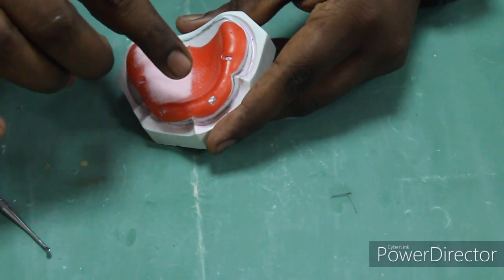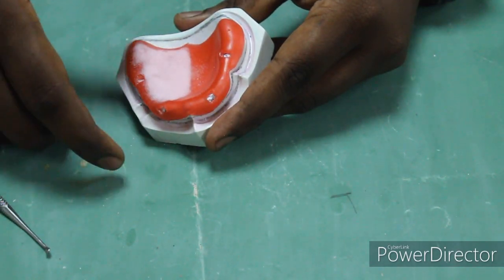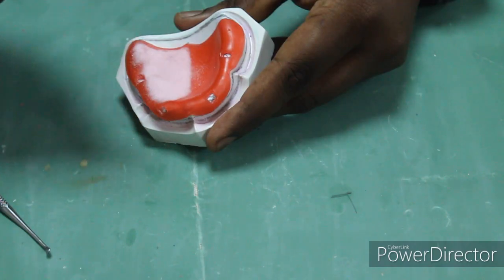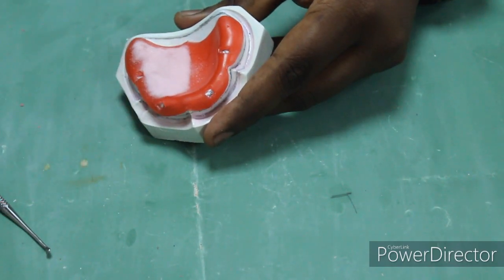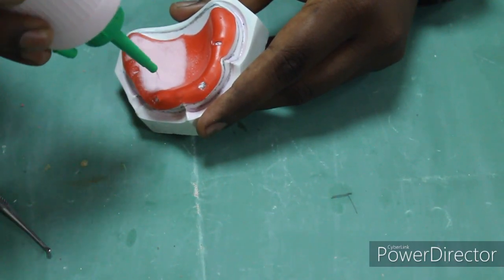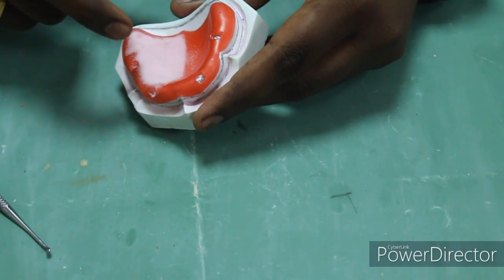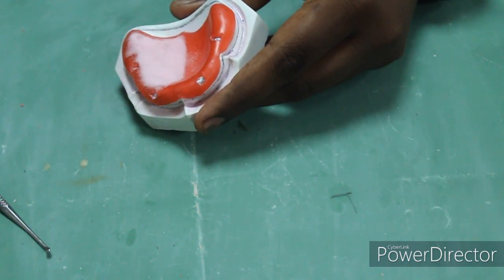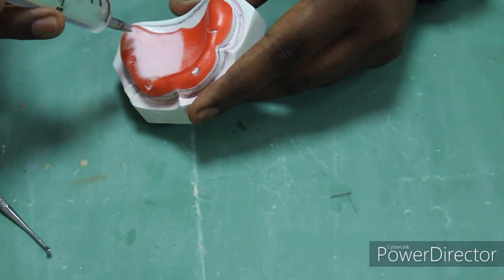So I have applied a thin layer of Vaseline on this wax surface. Why? Because it allows the easy retrieval of the wax spacer during the final impression. So after I added the powder on the surface, I will be keeping it in a particular angulation so that this powder will not flow from the desired position. So once the powder has been added, we have to drop the liquid on the powder.